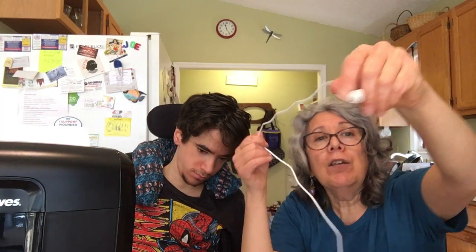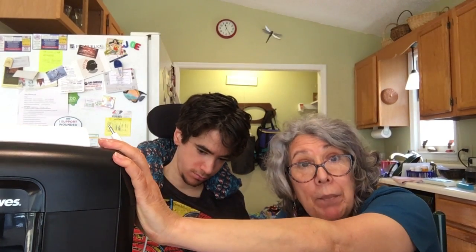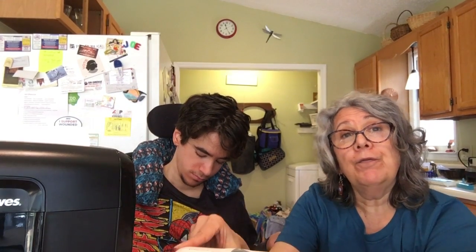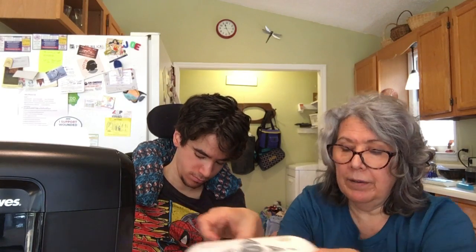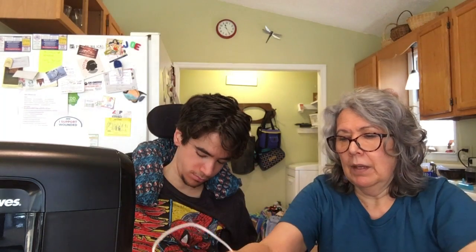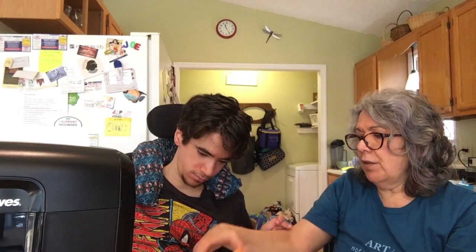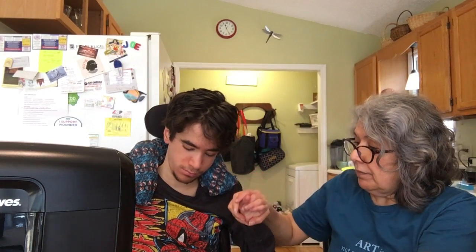Now, why do we need this PowerLink? Well, because this switch has this kind of a plug, and there's nowhere on this paper shredder for you to plug this into. So this is basically like a real fancy extension cord. So you plug this in, and you turn this on. Put the paper in the shredder, make sure everything is on, and then, I guess we'll use your right hand today, Joe.